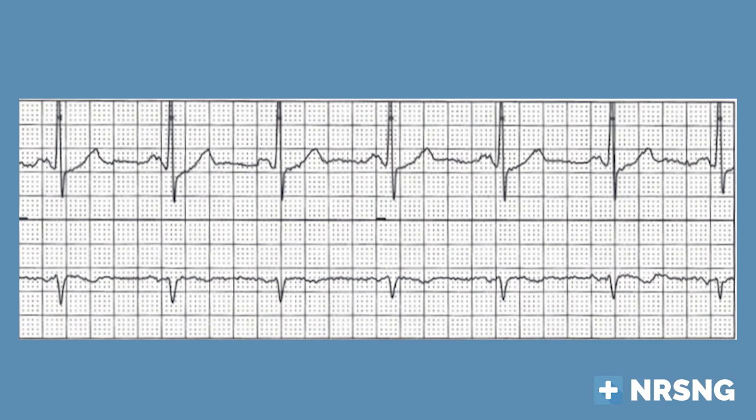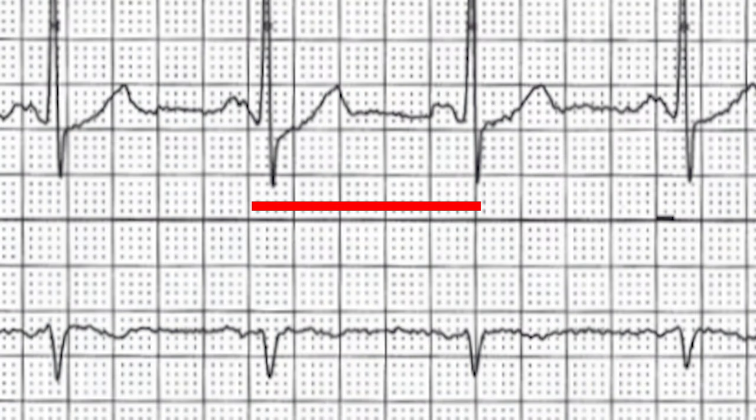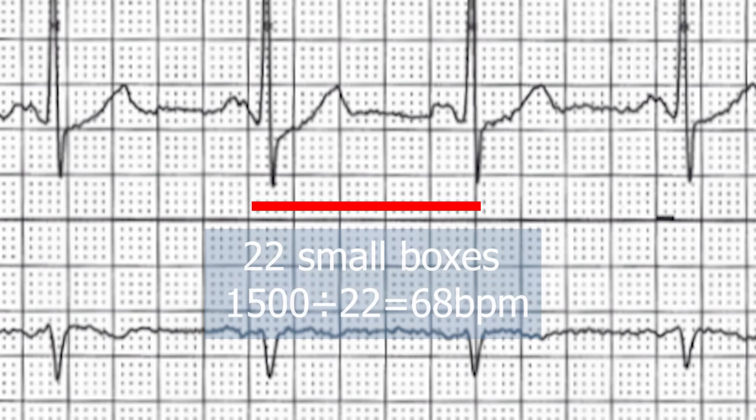To check rate, there are two main methods. If you have a six-second strip like the one you see here, count the total number of QRS complexes and multiply by 10. In this case, there are seven beats in six seconds, which means 70 beats per minute. These are relative estimates, but you're really just trying to see if it's too fast or too slow. The other method is the 1500 method — count the small boxes between two QRS complexes and divide that into 1500. So if you've got 22 small boxes, 1500 divided by 22 gives you 68. The six-second method gave 70; the 1500 method gives 68 — a little more accurate.